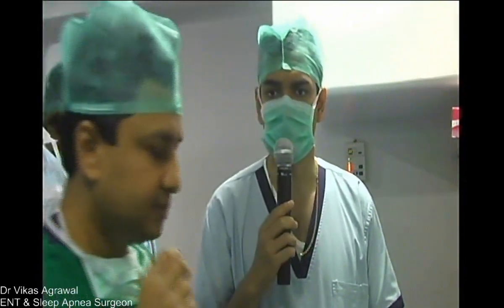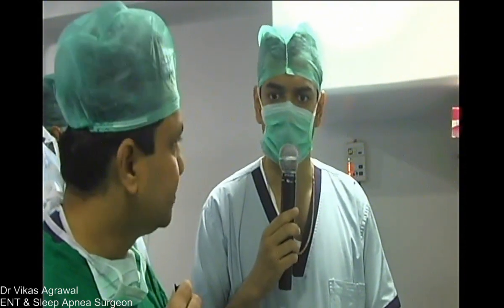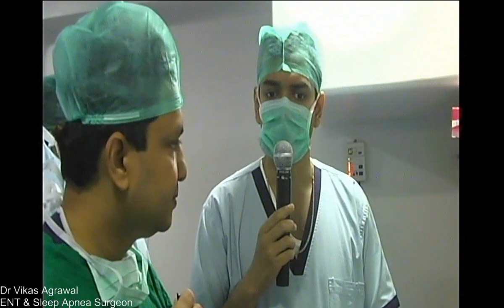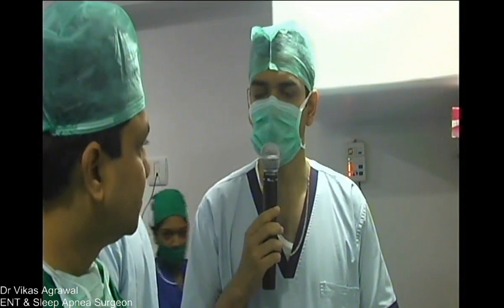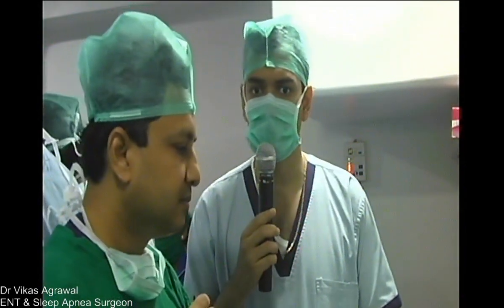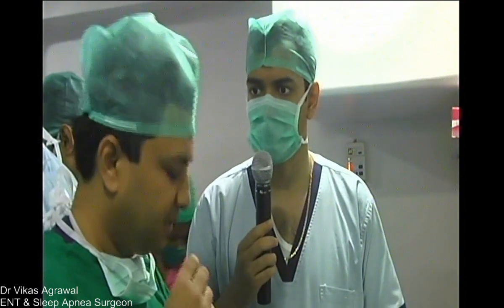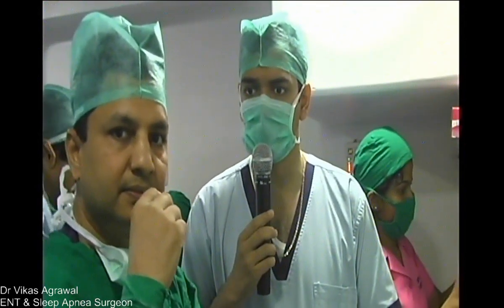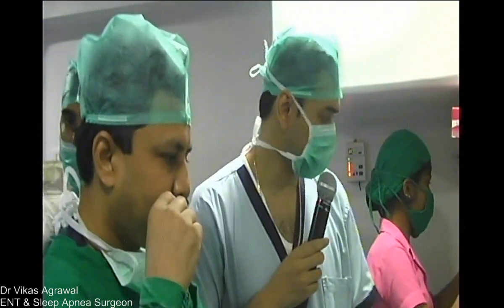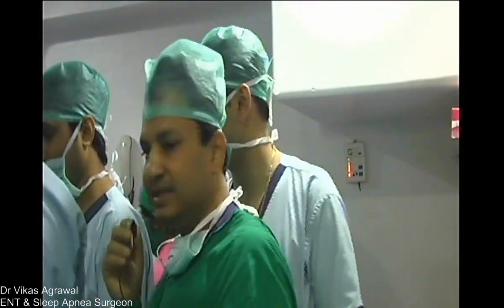Right. So another thing that one must also glean from the literature is that CPAP compliance rates are traditionally very poor. Correct. So if you prescribe CPAP to about 100 people, only about 30 will actually stick to it. So in terms of success rate, it's not that every patient who is not a good candidate for surgery may be a good candidate for CPAP. I mean, weight reduction is one thing. I'm sure Dr. Vikas advises it to everybody. And lifestyle modifications, simple things like cutting down alcohol intake, and also getting on an exercise routine. So now Kalpesh, can you show it here?